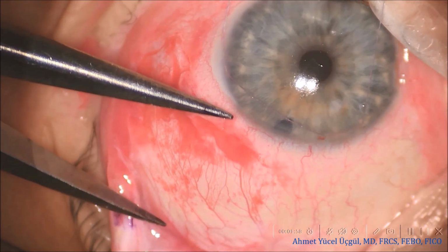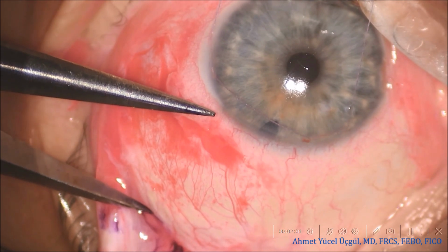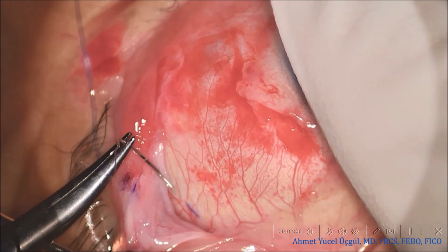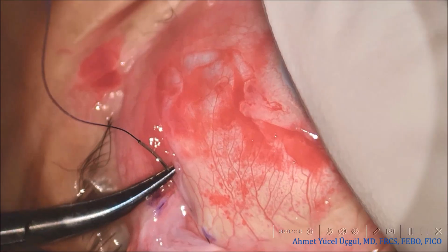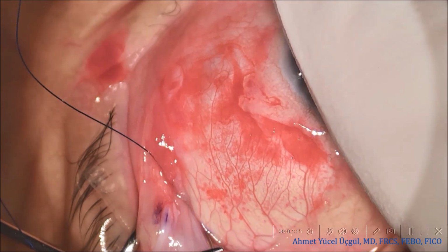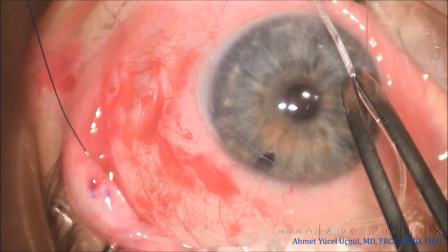At this point, the plate is secured with 6-0 Prolene fixation sutures, passed approximately 12 mm posterior to the limbus. I intentionally choose this distance to position the plate more posteriorly, with the aim of directing aqueous outflow not only toward the conventional bleb reservoir but also toward the posterior intraconal space. In my view, this posterior placement may help create a broader drainage pathway and potentially improve posterior flow distribution.